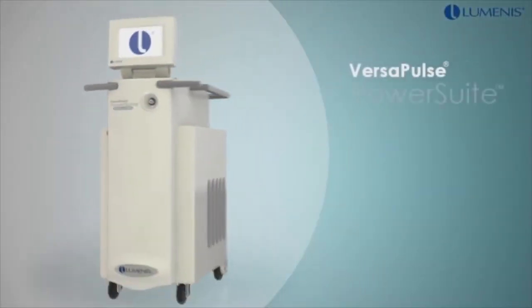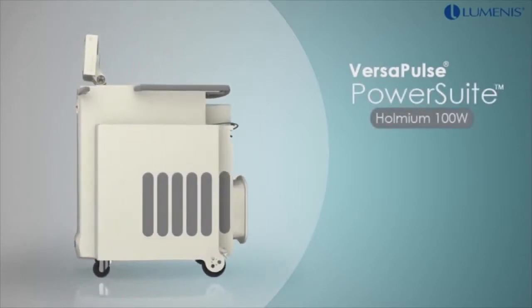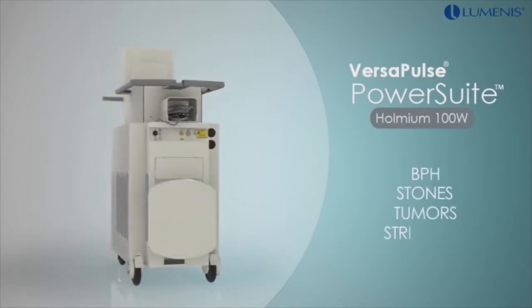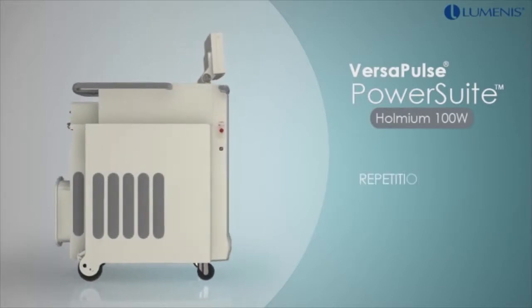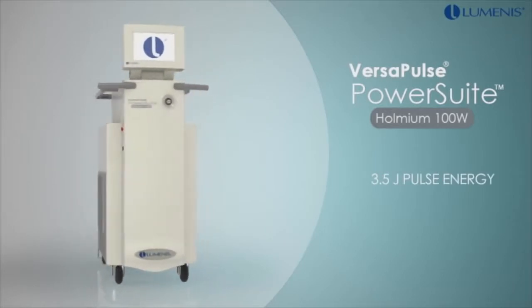The VersaPulse PowerSuite 100W Holmium Laser is best known for its urologic applications, treating BPH, stones, tumors, and strictures. This powerful system can deliver 100 watts of laser power with a repetition rate of up to 50 Hz and pulse energies as high as 3.5 Joules.